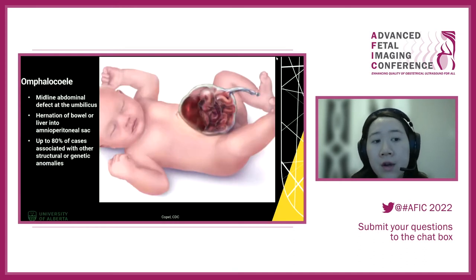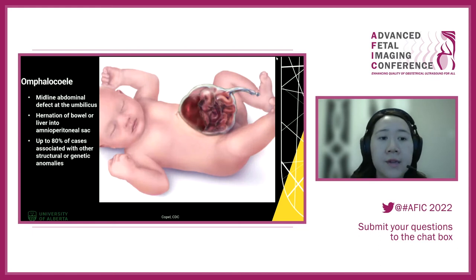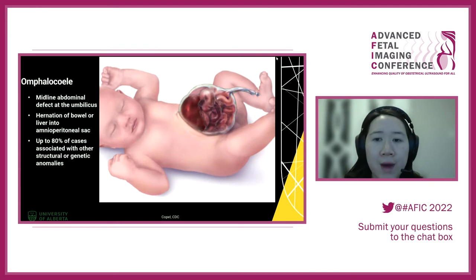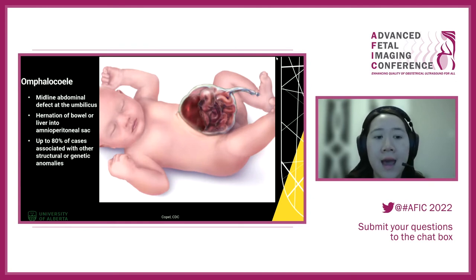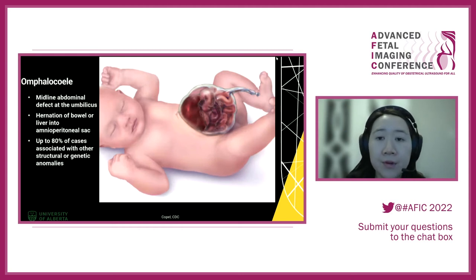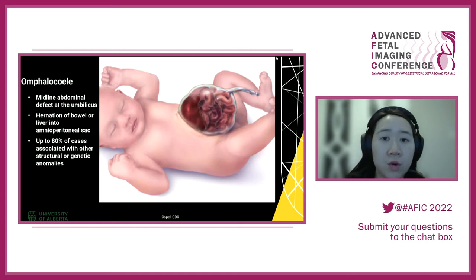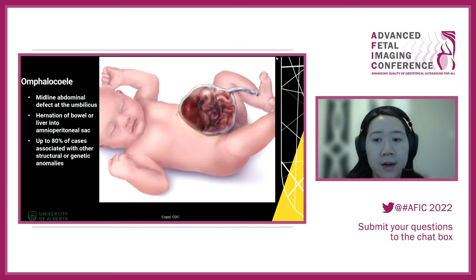Moving on to omphalocele: this is a midline abdominal wall defect where the peritoneal sac is still around that area and the umbilical cord comes out at the tip of that sac. Up to 80% of cases can be associated with either structural or genetic anomalies, so we do expect to see other signs.